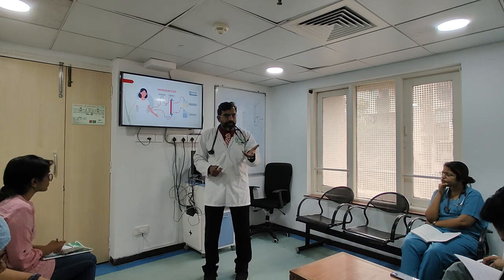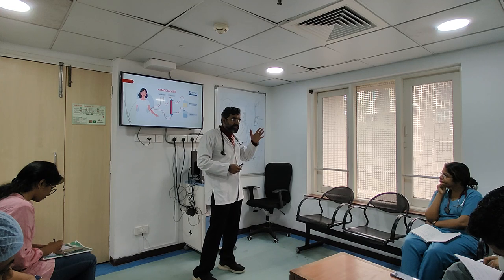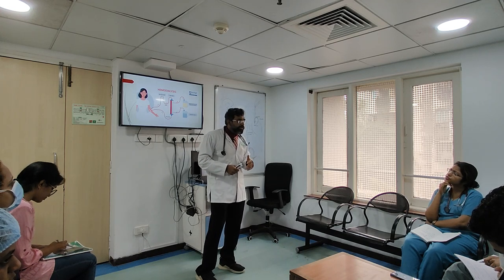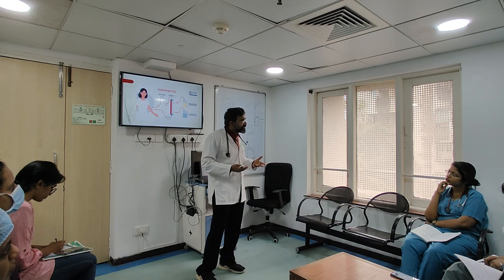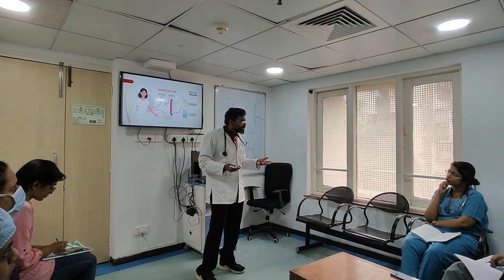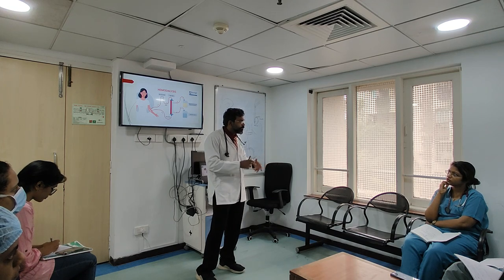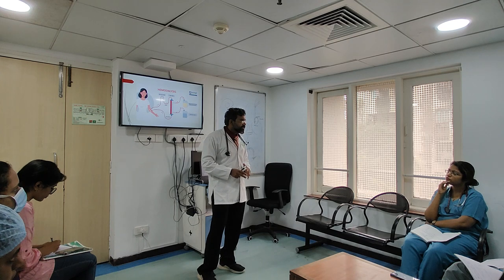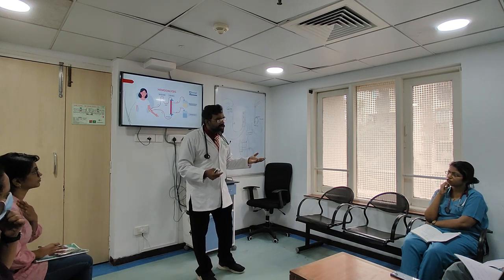It does a lot of damage to the therapy. At the same time, it changes all my pressure. Sachin, you're understanding? So we do change the lumen. It's wrong, no? Then I have to do a lot of jugglery after that to adjust the therapy and improve the efficiency of the filter. The moment you change it, I do a lot of changes. But it doesn't make sense. Why should I make all the changes when things should be done the right way?